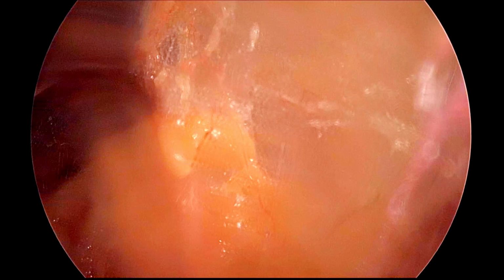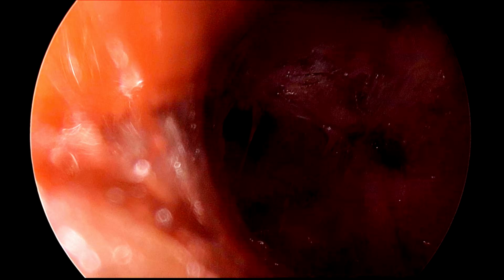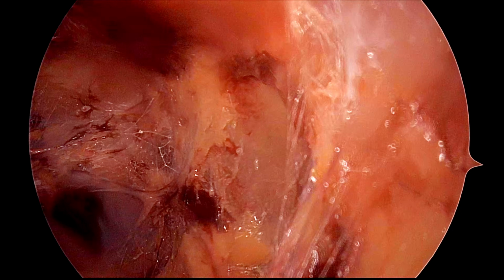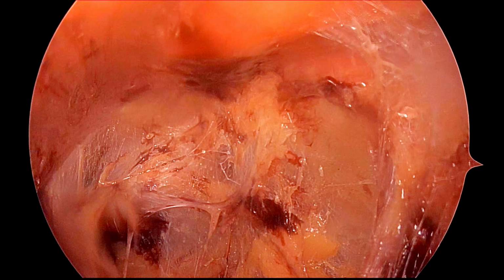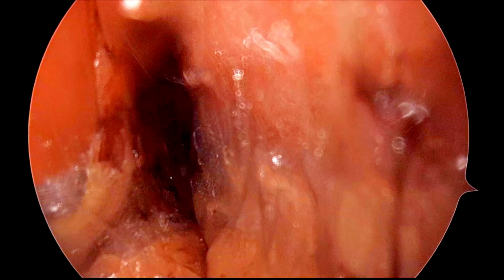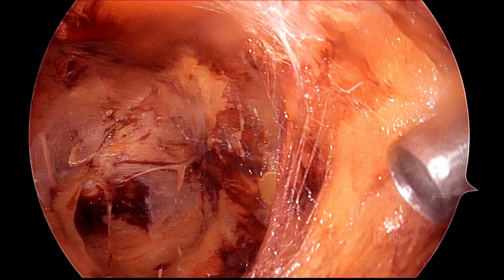Crossing over to the midline, it is going a little towards the left, so that we can put the additional ports. Now crossing over to the midline is enough, and the two other ports are introduced. These two are ipsilateral ports and these are 5 mm ports.